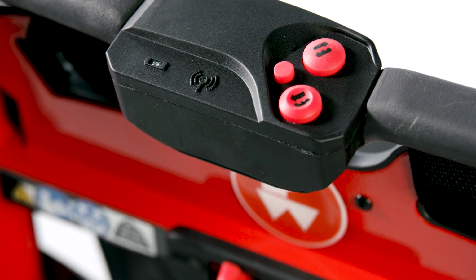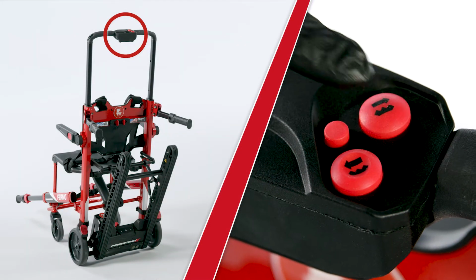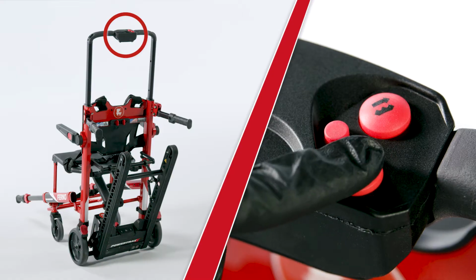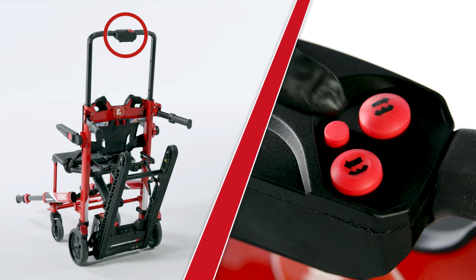A set of control buttons is attached to the extending lift bar. The Ascend button powers the tracks upstairs. The Descend button powers the tracks downstairs. The small red button controls the scene lights.